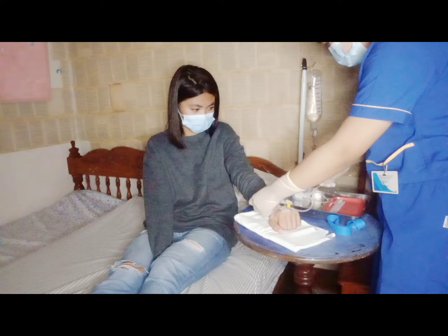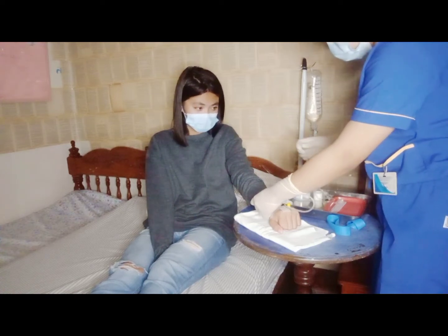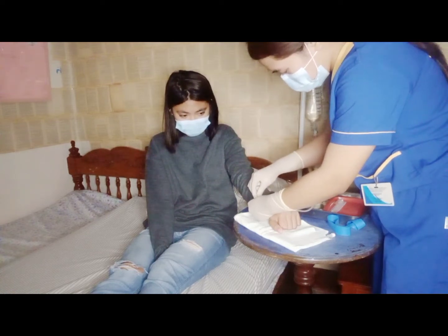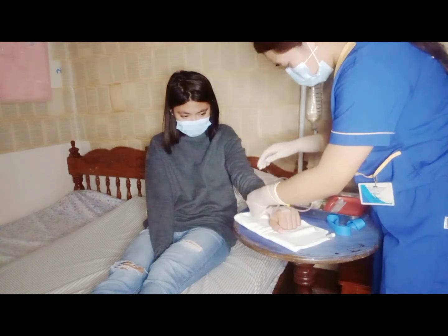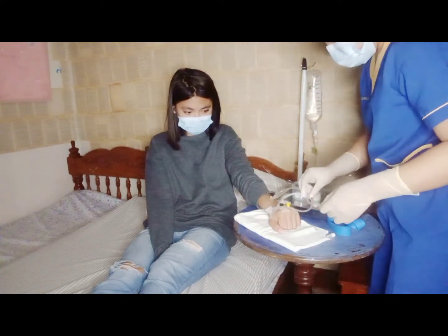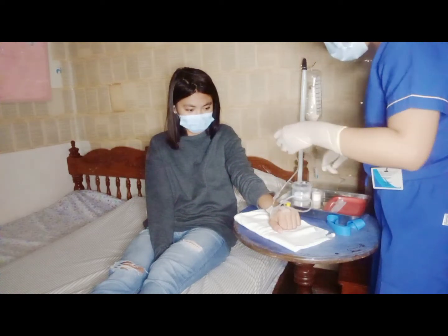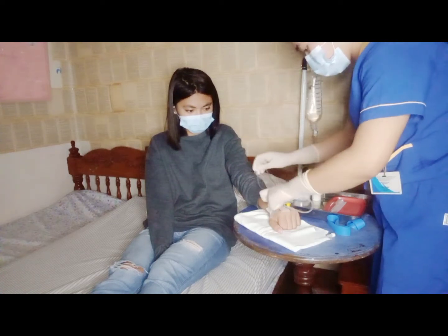And then we will attach the IV administration set. Okay, and after attaching, we will loop and anchor it with tape near the entry site.